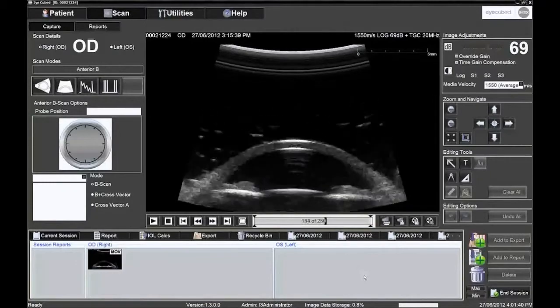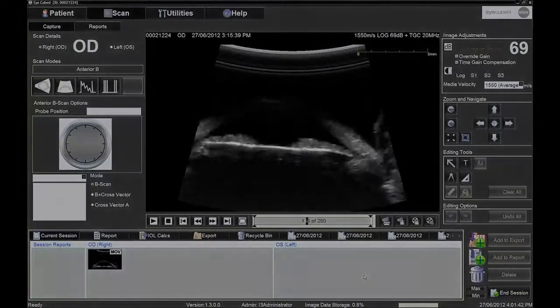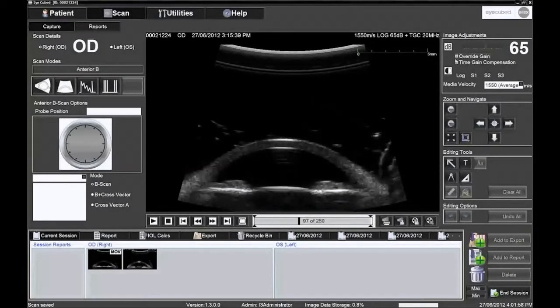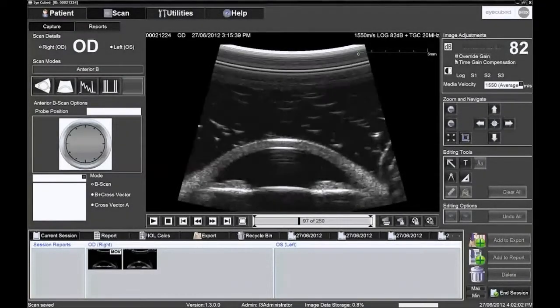The 250 frames can also be played as a movie. On the iCubed, the gain can be adjusted after the picture has been frozen to better visualise the pathology in terms of its surroundings.